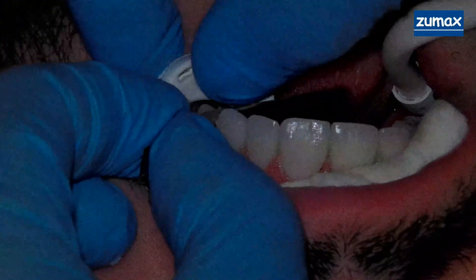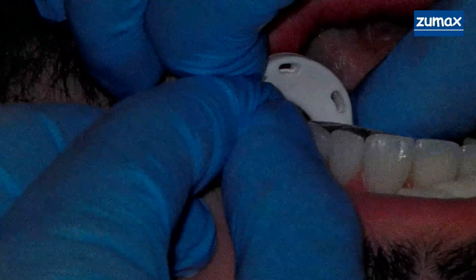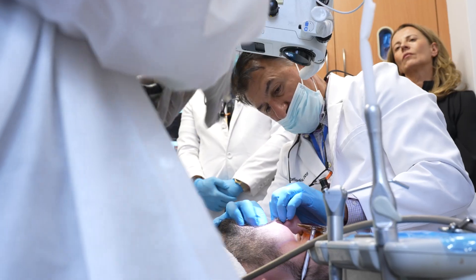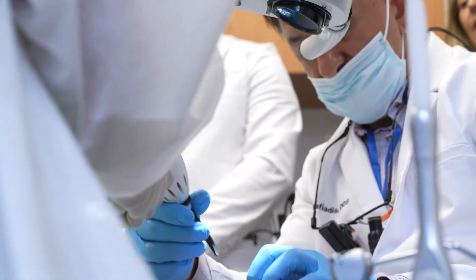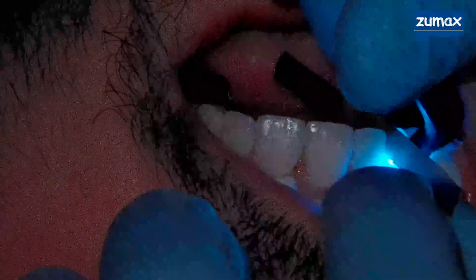I'll do the same thing on the right side. Out towards the lingual on the canine here. White — hit it. There's no rush here. You're taking your time. It's your stuff. So there's no rush.